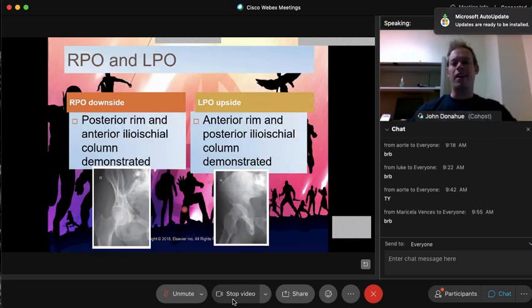And that's what they're going to look like right there. It really doesn't look a lot different. It's just going to slightly open that acetabulum a little bit more. It's not going to be a huge difference, but it is going to slightly open up that hip joint, giving a much better visualization for that doctor if they suspect something funny is going on inside that hip joint very deep.